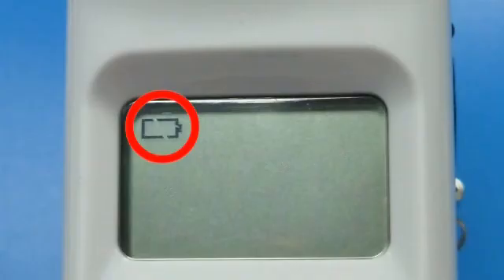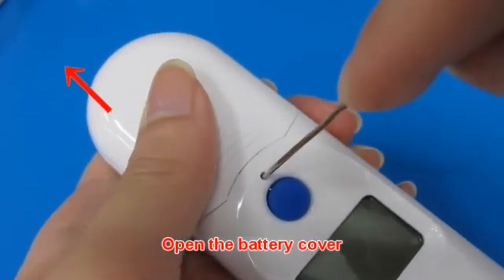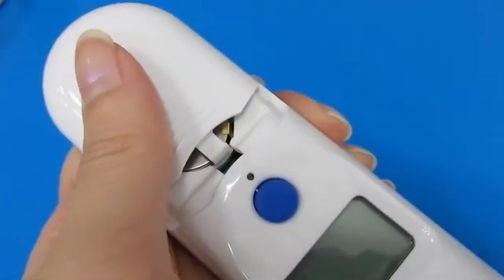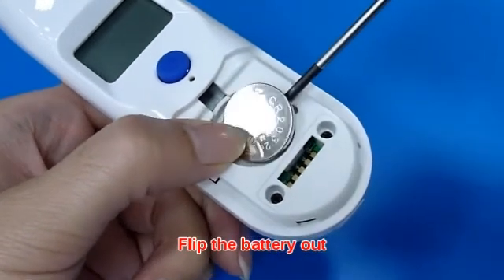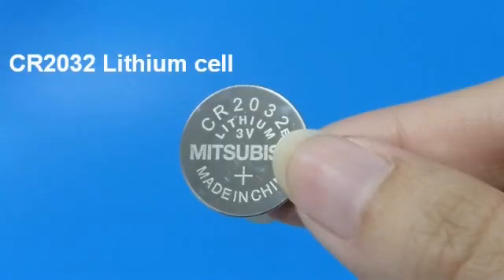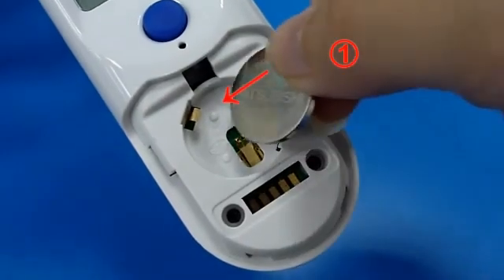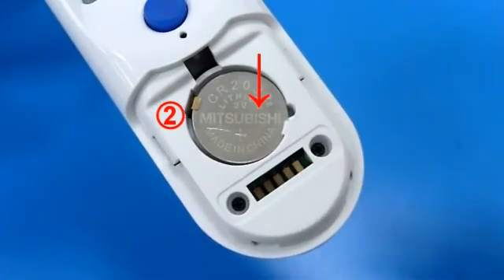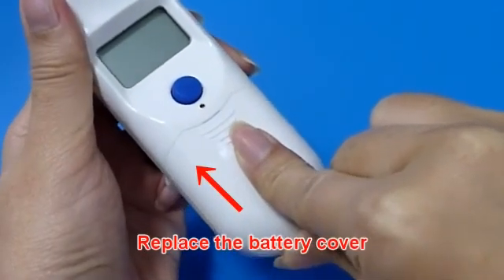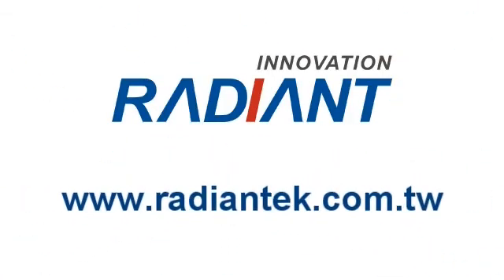When a low battery icon appears, please change the battery. Insert a pointed object into the battery cover pin hole, then use your thumb to push the battery cover out. Hold the device and flip the battery out with a small screwdriver. Insert the new battery under the metal hook on the left side, then press the right side of the battery down until you hear a click sound. Replace the battery cover. Visit the Radian website for more information.